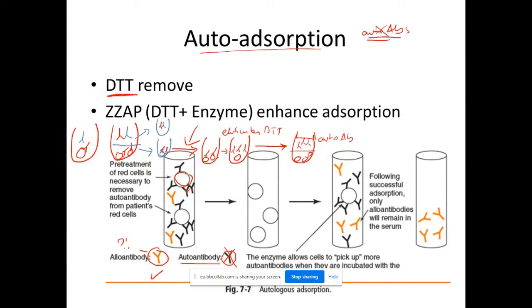After the DTT, it will dissociate from the antibody, it will dissociate from the cell. Do centrifuge. The upper layer will contain the auto antibody. So this one I will discard. لأن auto ما بيهم صح؟ طيب لكن هذه ذكرون قلنا بنستخدمها as magnetic. الحين هذه صارت free صح؟ free patient cell. شوفوها هنا free ما عليها الاوتو انتي بودي لان خلاص احنا سوينا لها dissociate وديسكارد السوبرناتنت.